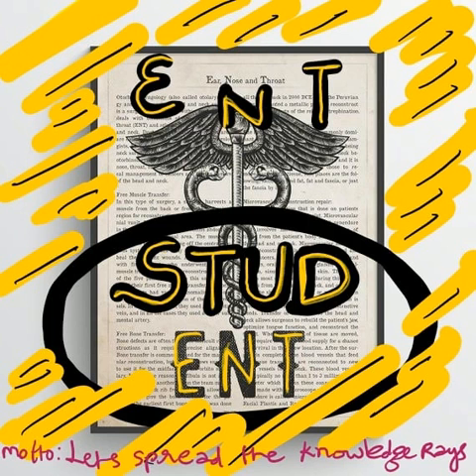Cortical mastoidectomy is complete once the posterior canal wall lies anteriorly, the tegmen tympani superiorly, the sigmoid sinus posteriorly, and the digastric ridge inferiorly, with the lateral semicircular canal in the floor and the shadow of the incus well delineated and clearly visible. In the end, the cavity is polished using a diamond burr.